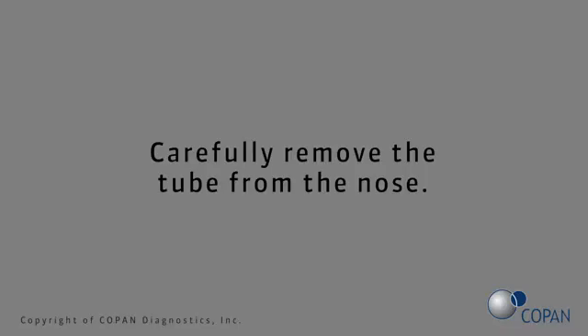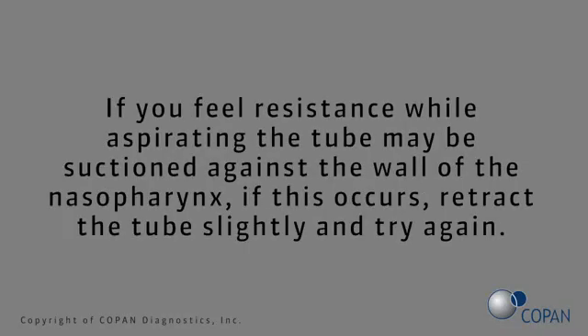Carefully remove the tube from the nose. If you feel resistance while aspirating, the tube may be suctioned against the wall of the nasopharynx. If this occurs, retract the tube slightly and try again.